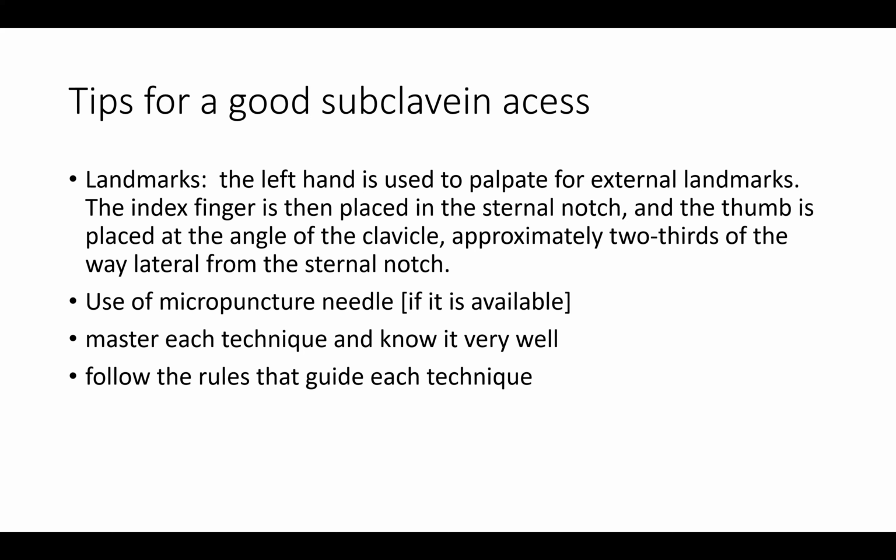So micropuncture needles are a key thing, because if you puncture the artery or you inadvertently puncture anything that is not supposed to be punctured, the micropuncture needle will save you from having bleeding or pneumothorax. So after you use the micropuncture needle, you can now change over to your regular device system, and you can now move on with it.